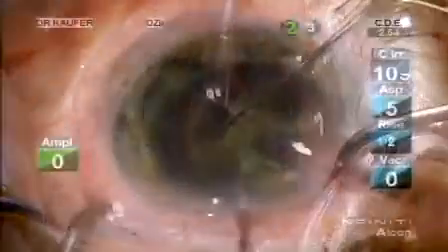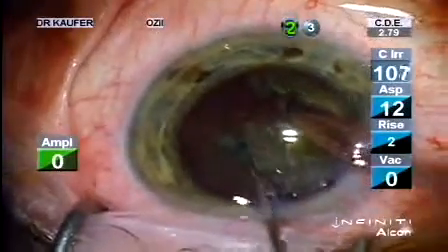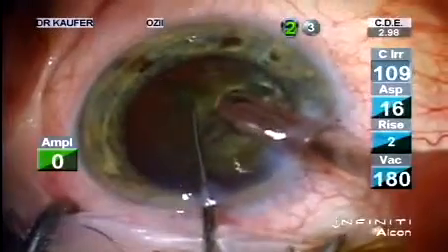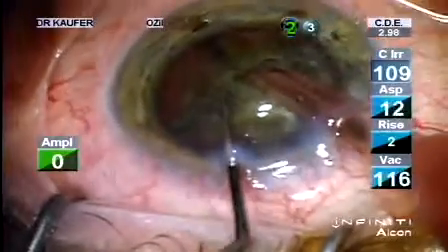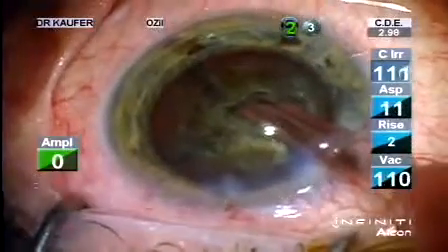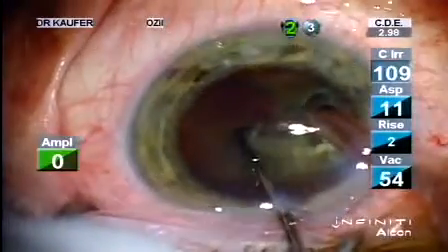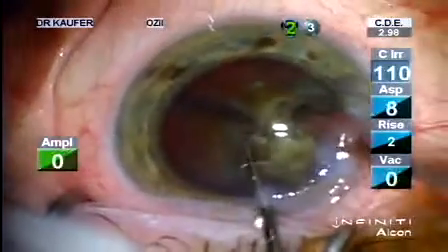Now it's very important to get as many pieces as possible before going to quadrant removal, and making sure that that crack is gone all the way down in the center. Now this is a very sharp chopper, so now that I have 4 quadrants, I will change and go for a blunter chopper so that I don't risk. There we go.